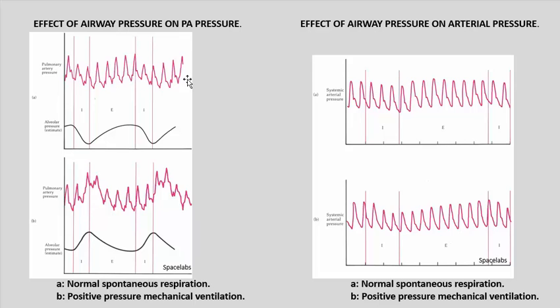You can't win. However, now we're going back to recording the mean of all the systoles, the mean of all the diastoles, and the mean of all the means. And to my mind, that has always been a more statistically meaningful and physiologically meaningful value to report. But we go with the flow.